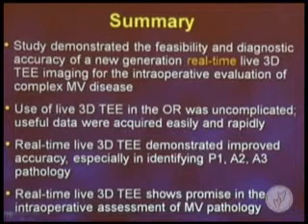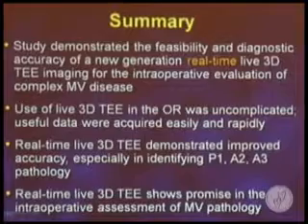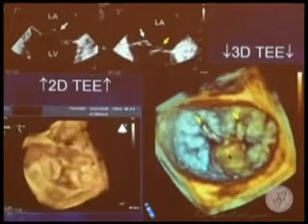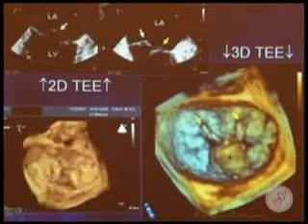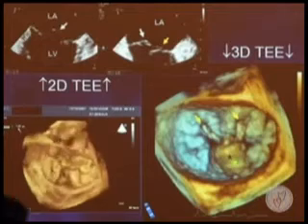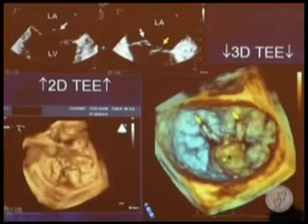To 2D echo in the operating room in a prospective group of patients, especially beneficial for these particular regions of the mitral valve, and it shows great promise in mitral valve pathology. Now here's just some examples from the study. The diagnosis of a flail posterior leaflet can be made by 2D echo, but look how much better we can delineate the actual leaflet pathology by 3D.